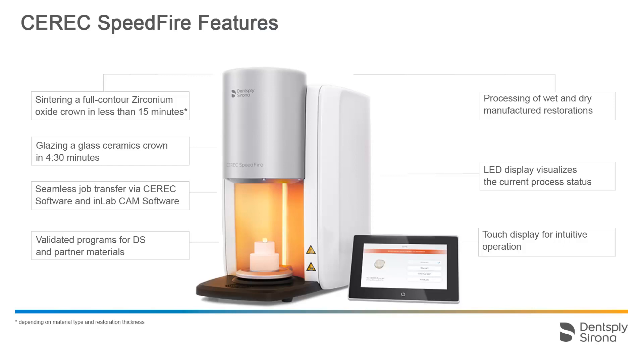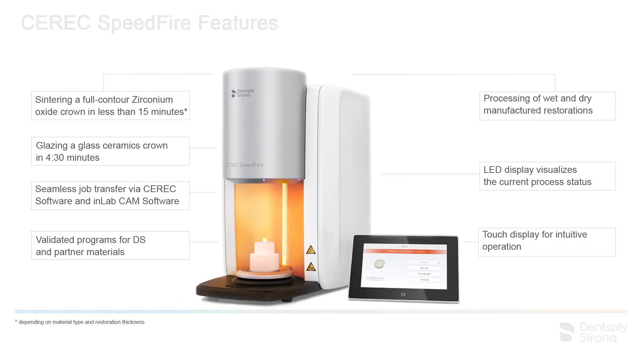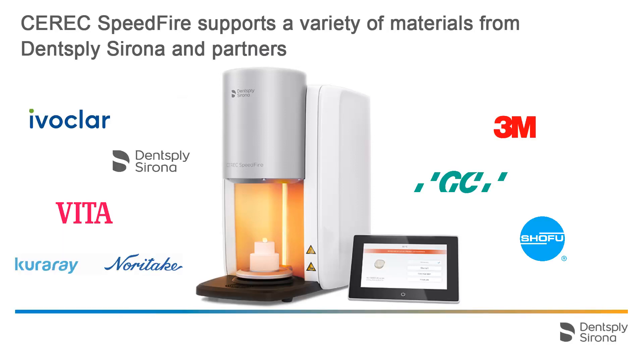Next, we will provide an overview of the materials that can be processed with the CEREC Speedfire furnace. CEREC Speedfire offers a variety of validated programs for Dentsply Sirona and partner materials. These validated programs were developed specifically for CEREC Speedfire by the manufacturers of the respective materials in order to ensure excellent aesthetics and high material-related strength.